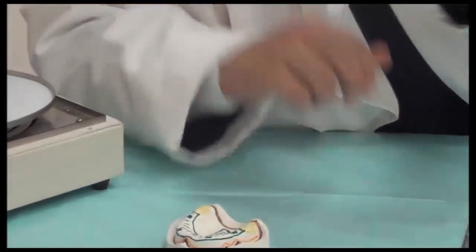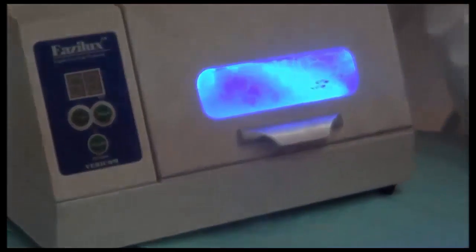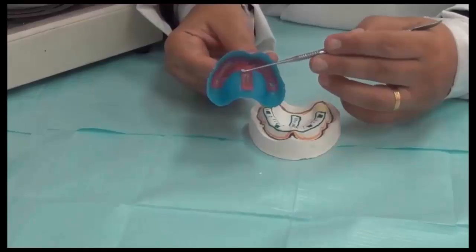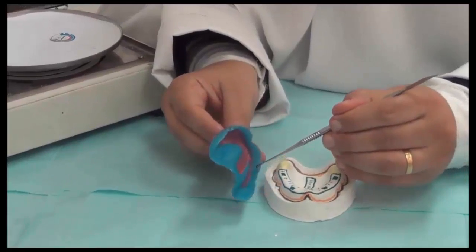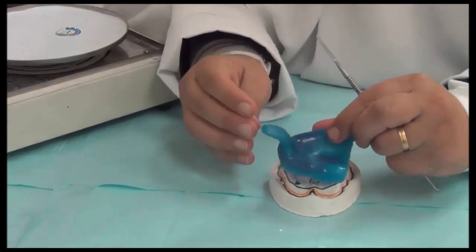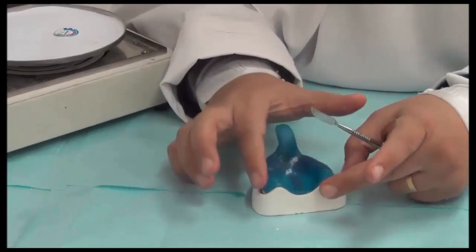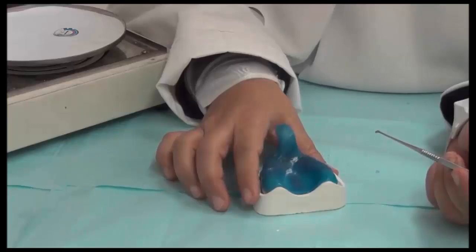So we are inverting it from the other side, and we're doing a second cycle of curing. Once removed from the light cure, we find that wax is embedded inside our tray. The tray material covers all of the borders, so no wax is exposed to the borders. The borders are fully cured, the handle is fully cured, and these borders follow the border shape we had in the beginning. And notice that the adaptation of the tray in this case is fully adapted. Not a lot of shrinkage happened because we covered the palatal area and reduced the shrinkage during the setting.